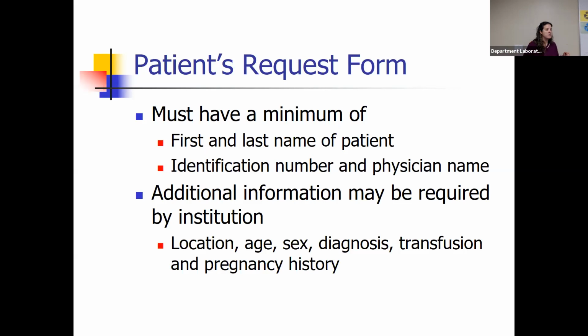Sometimes specific floors are associated with specific conditions, such as maybe it's the orthopedic floor. So maybe they're scheduled for orthopedic surgery, or maybe they're on the vascular floor. Maybe they're in OBGYN. Okay, that will help you know what's going on with your patient. The location can be very helpful. And then your transfusion, were they recently transfused? And if it's females, how many pregnancies has she had? Okay.